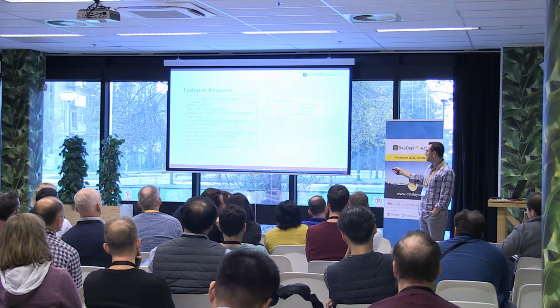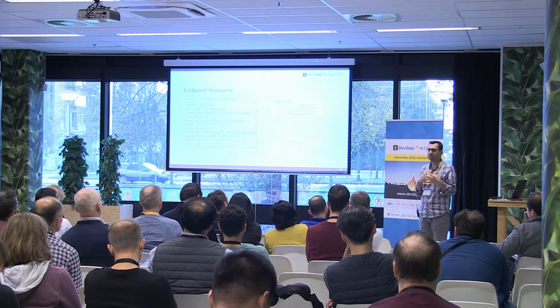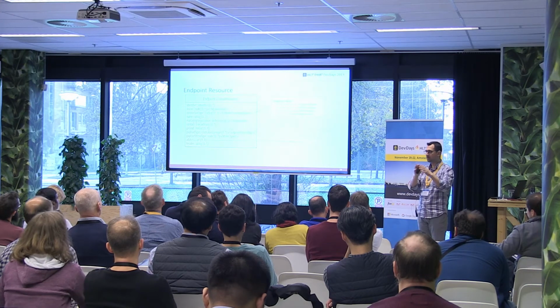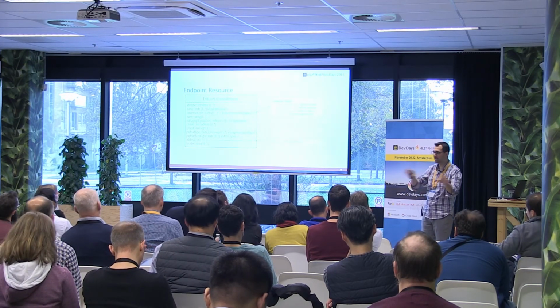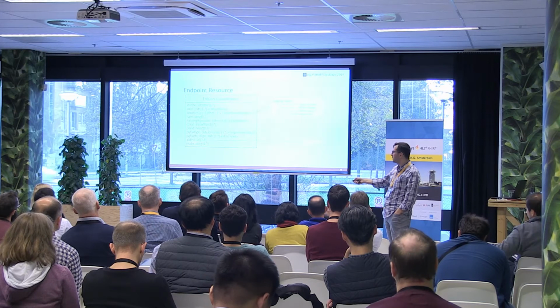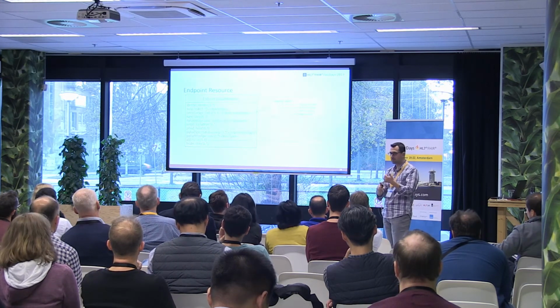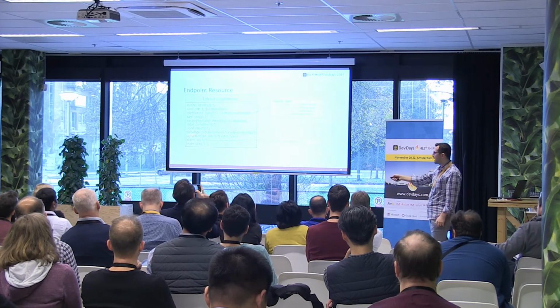Now that being said, if this is not populated, usually most institutions will have some kind of image viewer where you can basically just open it up in a new tab or a new frame, pass the identifier and be like, here, take over. I don't want to deal with this. Okay, and then of course the URL right here, which is where to go for whatever information that you're looking for, whether you're retrieving, trying to display, trying to get more information. This is the actual URL here.